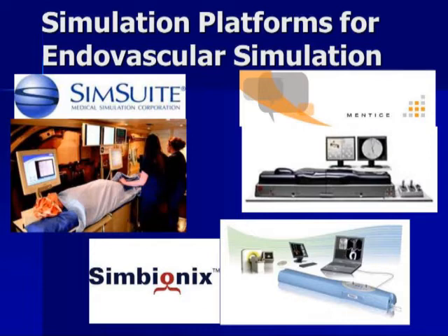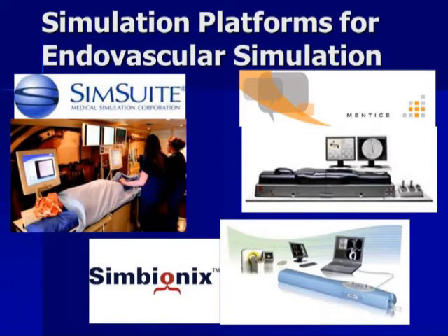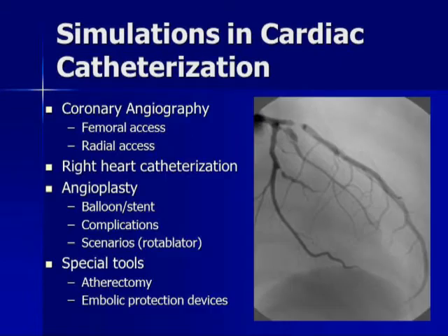There's actually 4 simulators, and I apologize, I don't have the CAE simulator on here, but it was from Immersion Medical. But CAE is a huge flight simulator company that's purchased that. But in endovascular simulation, SimSuite, the MSC, which is actually based here in Colorado, Mentice and Simbionix really have huge traction, and all have had significant improvements in their haptics, in the angiographic display, as well as the content and the breadth of programs that they're able to train folks on.